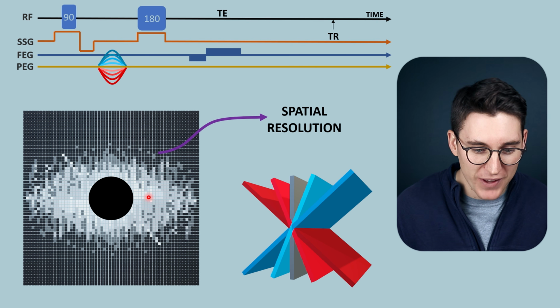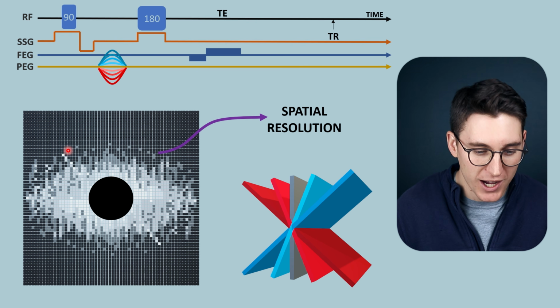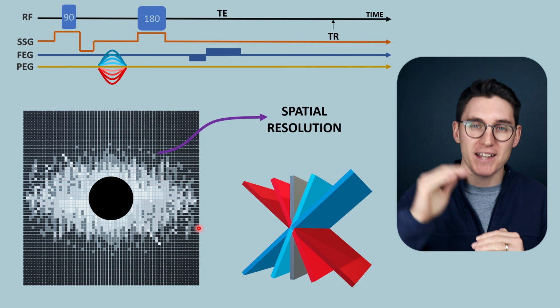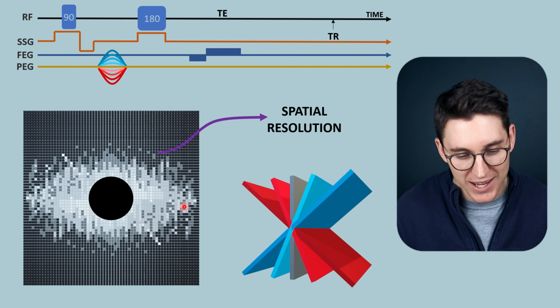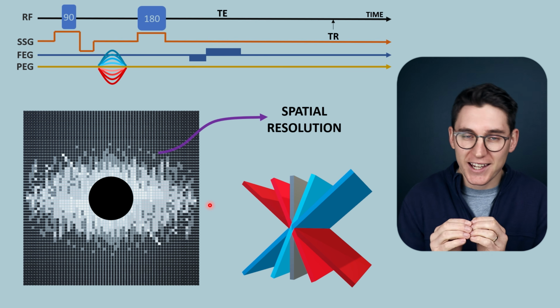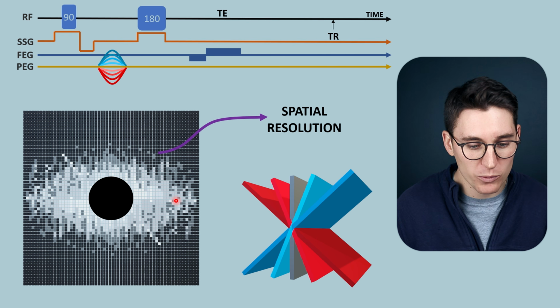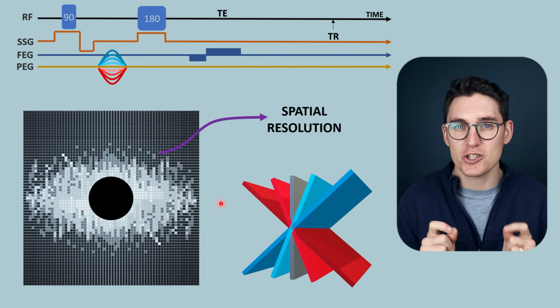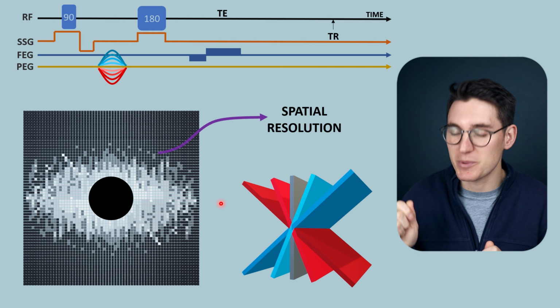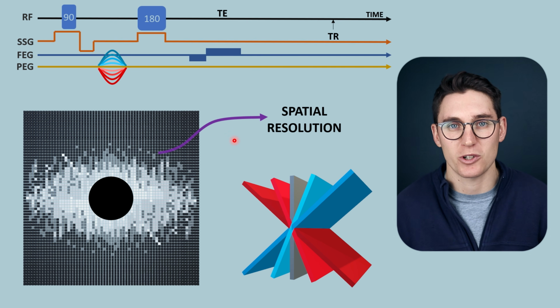Now, in actual fact, the way in which we store K-space data is slightly different to how I have represented it here, with phase encoding and frequency encoding steps happening in the x and y-axis directions. This, in my opinion, is a level above what we need for Part 1 radiology exams. The way in which we've explained it here will give us enough intuition to allow us to create specific pulse sequences that will generate the types of images that we are trying to acquire.